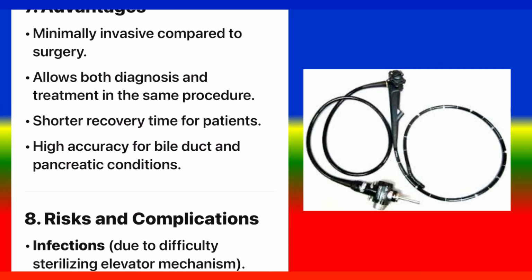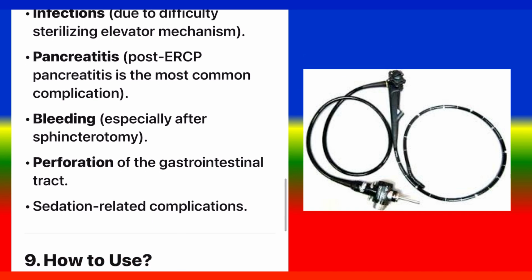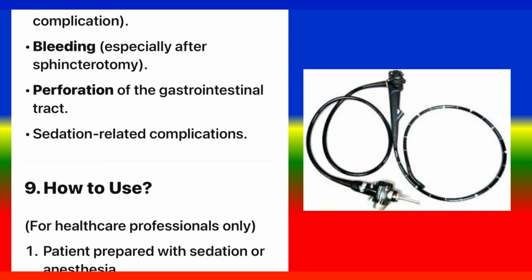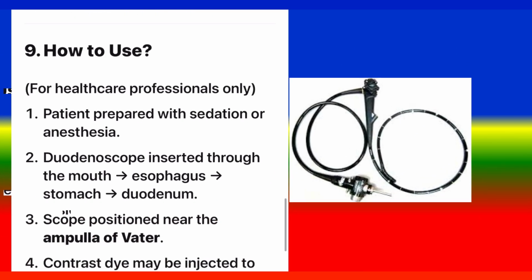8. Risks and complications. Infections due to difficulty sterilizing the elevator mechanism. Pancreatitis; post-ERCP pancreatitis is the most common complication. Bleeding, especially after sphincterotomy, perforation of the gastrointestinal tract, and sedation-related complications.